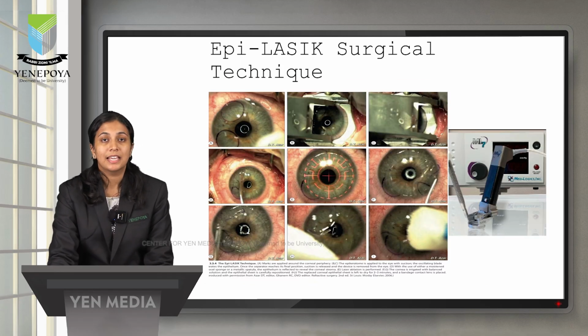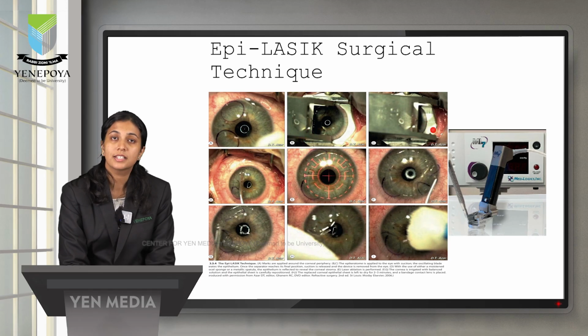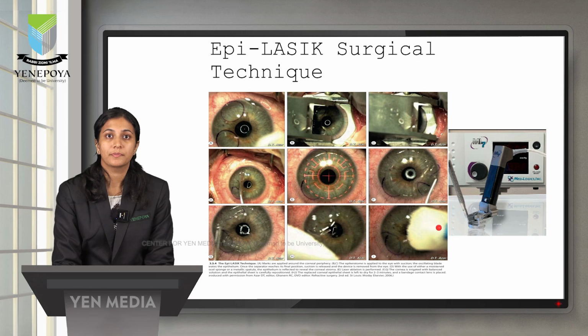Coming to epi-LASIK. In epi-LASIK, an instrument called an epikeratome is used to separate the epithelium. As you can see in the image, first the cornea is marked and a suction ring is placed with the epikeratome. This epikeratome has a blade which passes over the cornea. Once it reaches the opposite edge, the epithelium gets separated as a single sheet. This sheet is raised, and the rest of the layers of the cornea are ablated using excimer laser. After excimer laser's job is done, you place this epithelial sheet back and place a BCL over it.